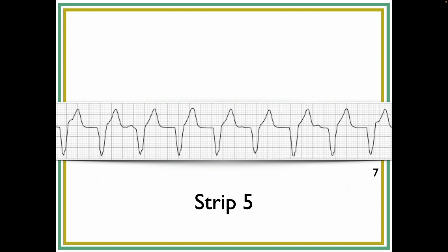Okay, so Cody, strip 5. What did you call that? So, this would be VTAC. What's the rate on it? I got 111-ish. Really? That one looks different than mine. Which one are we on? We're on page 25. Is it different? Mine looks a little faster. Okay.